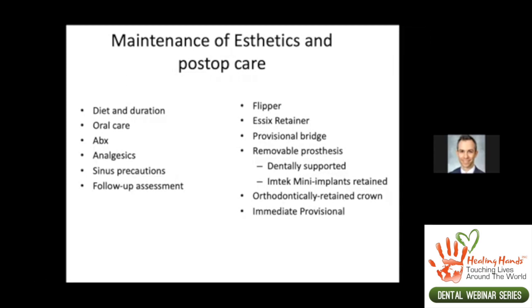pressure, because that pressure is going to lead to earlier bone resorption. And then when you come back, you may not have enough bone to place an implant. So just something to consider there.